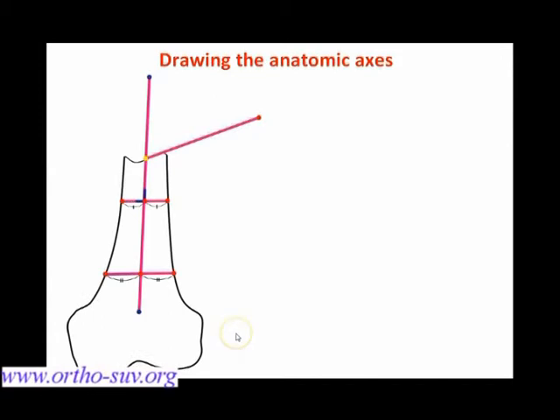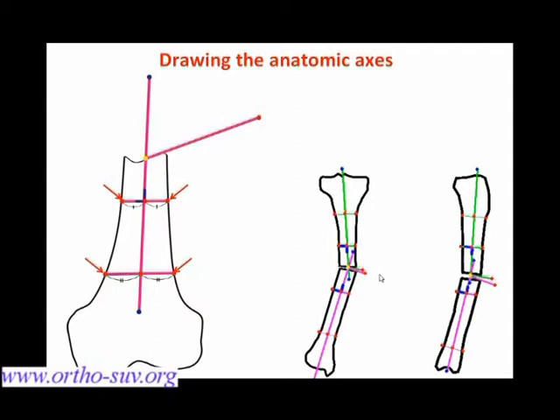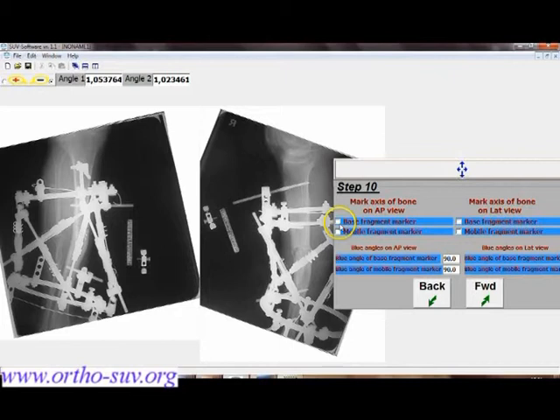How do we draw the anatomical axis? In diaphyseal deformity, we mark it by placing the red points on the cortices of the bone fragment — you can see this shown for the distal femur and for the tibial bone. The yellow point is usually placed on the border of the bone fragment when there is no gap between bone fragments. The same procedure is done on the lateral view.